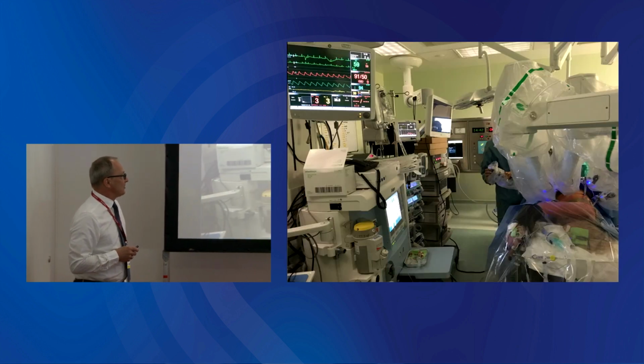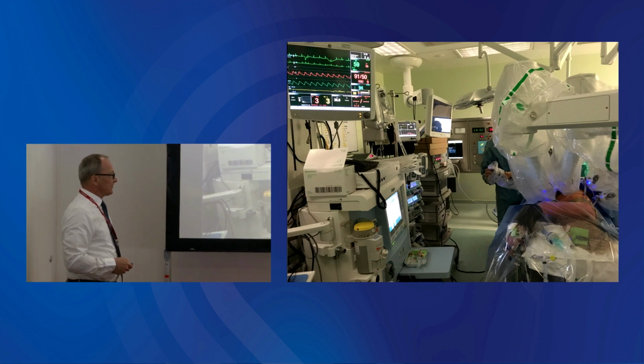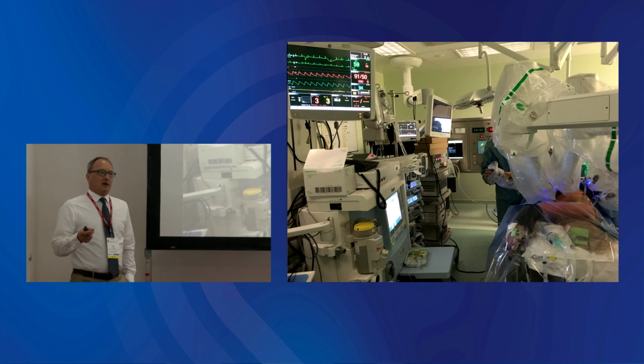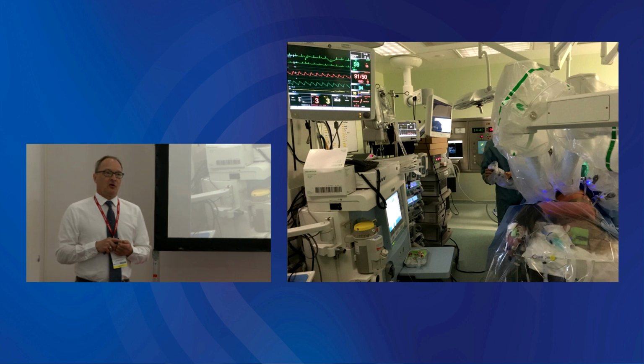Now, this is our setup. The patient, I don't know if you see, is on the side, under this sort of little canopy and a plastic cover. His arm is on a wee up-sided gutter, and the question here was which side of the patient, which arm, which finger we should use the NOL.